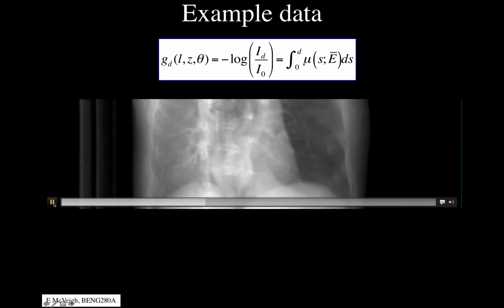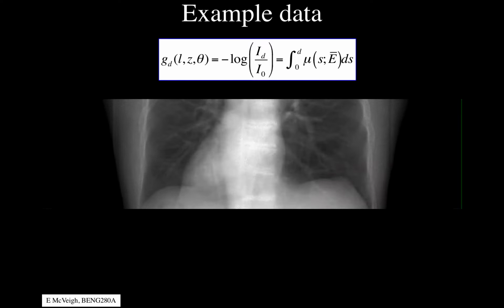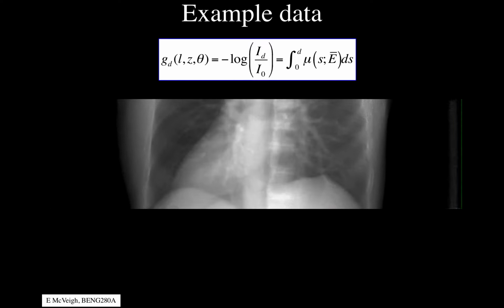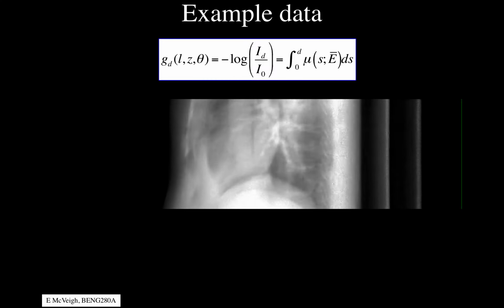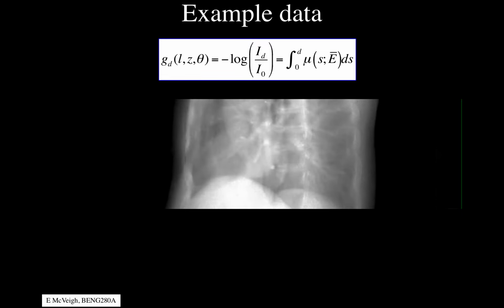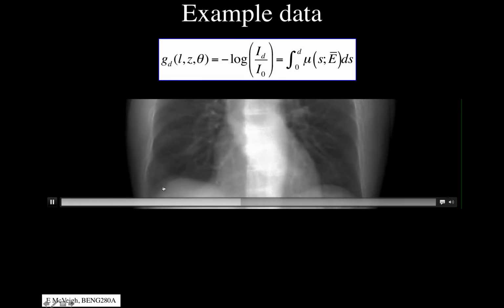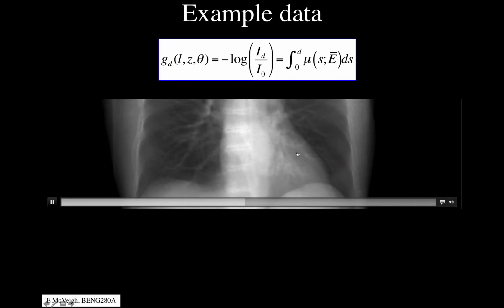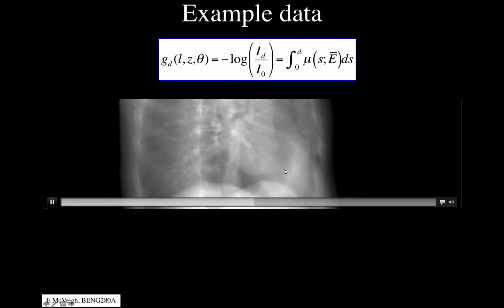So noise in X-ray is a little complicated. The higher your contrast, the higher your noise, because contrast is attenuation of photons. But if you attenuate them all, you get a very low confidence estimate of how many you have. But you can see details, and this is the data that is used to reconstruct a 3D image.